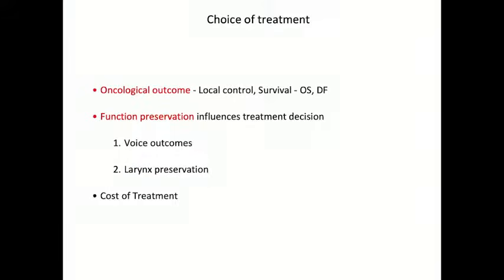When you look at outcomes, when you look at evidence, transoral laser surgery is equivalent to radiotherapy. There is no randomized trial, but long prospective and long retrospective data from India and abroad show that there is no compromise in cancer control between laser or radiotherapy. So the next important determinant to decide between laser and radiotherapy is function preservation.